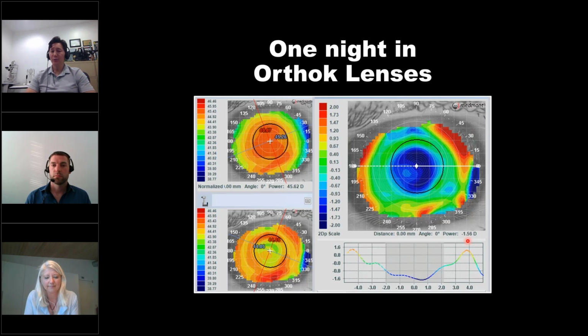Now, if we were to do an autorefraction on this patient, the autorefractors tend to have a large entrance pupil. So there's a lot of aberration that the patient may be picking up, and the visual system interprets that as the need for more minus or more cylinder.